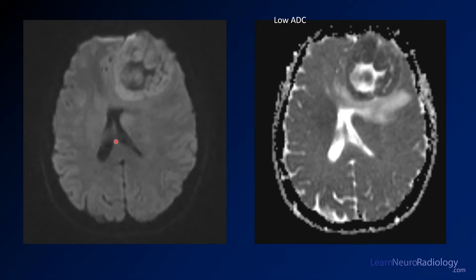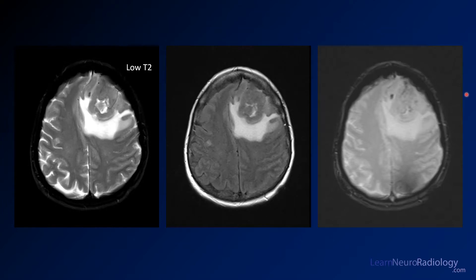On the MRI diffusion sequence, you look at the rim of this mass — it's pretty bright on DWI, and on ADC it's even lower. So you definitely have some concerns that there's tightly cellular material there. On T2-weighted images you see a thick rim that is quite dark — darker even than white matter. Surrounding edema is confirmed on FLAIR with fluid suppression.